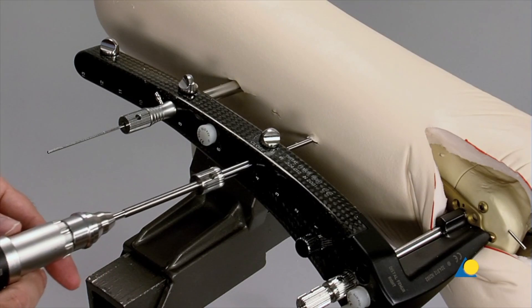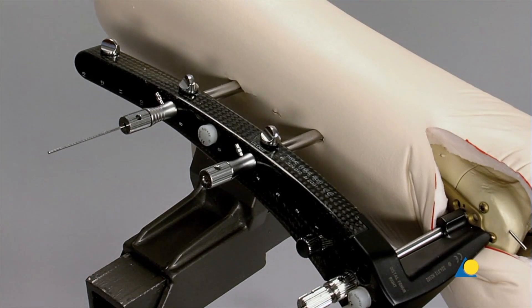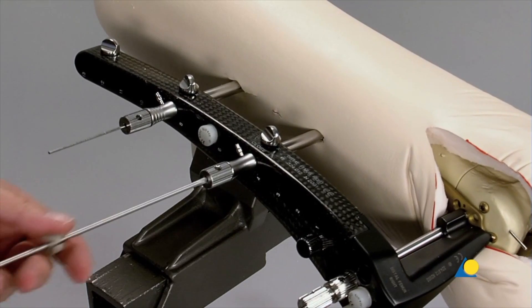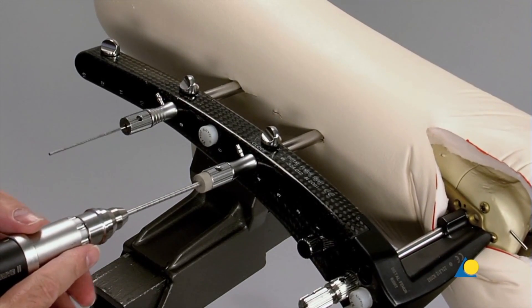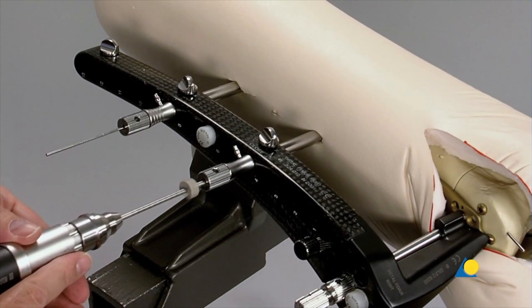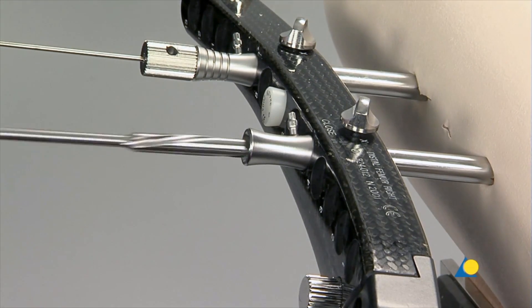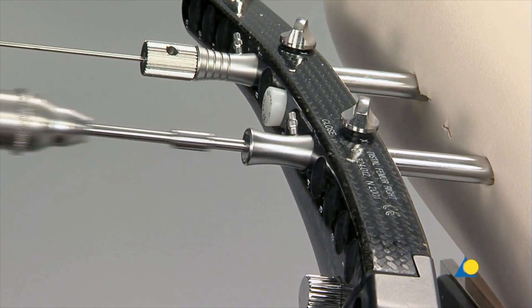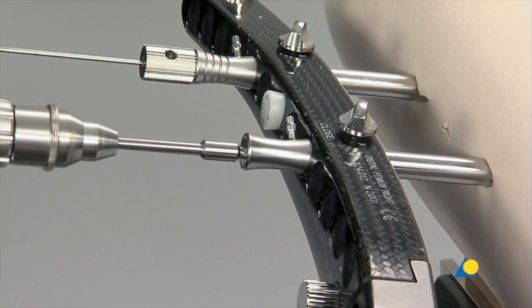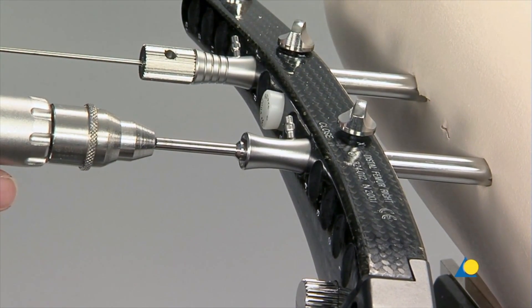The pull reduction instrument is removed and replaced with a locking screw. As the reduction device was only inserted monocortically, the far cortex must be drilled before the screw is introduced. In this case, self-tapping screws are used. 26 mm long self-drilling screws are an alternative for monocortical treatment where there is good quality bone.